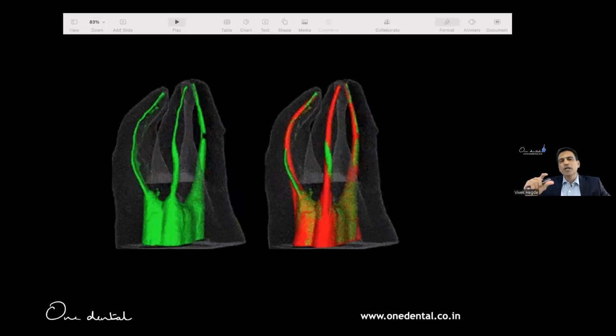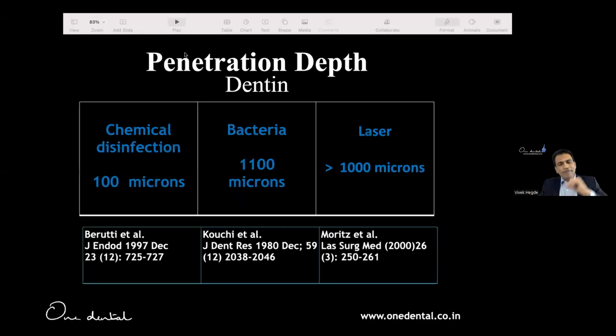Because of what is not called the vapor lock effect as much anymore, it can produce bubbles inside, air bubbles inside, air pockets inside, negative pressure inside. The surface tension of the chemical may be different. The contact angle of the chemical is different, because of which the irrigant may not have reached where it's supposed to reach. And that's why I want to use an activator to break down those bubbles, to carry the irrigant deeper up to where it's supposed to go, and then touch all the walls. That's the concept. So I'm going to show you why we're doing that.